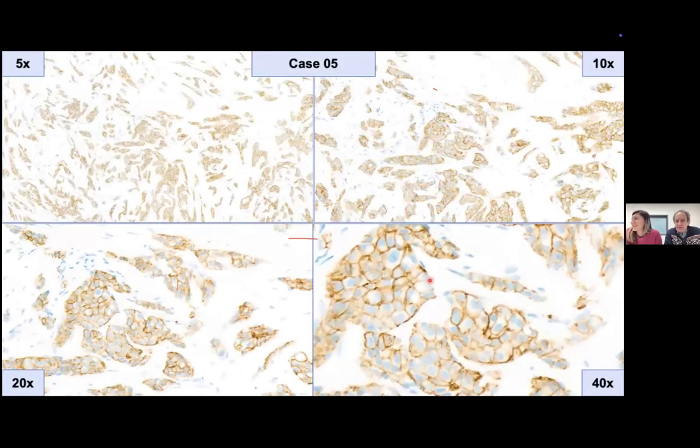Why the last one? We want to do more. Okay, so Simona, you score this. I can score this. I'm insisting now because I know the order, and I really wanted this one, the next couple, and then let's probably do a few more. I know that we are a little bit over, we don't have time, everyone. We are ending. No. We'll stretch a little bit.